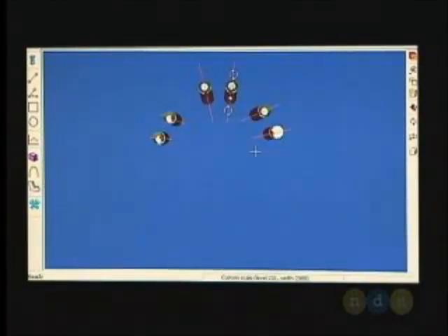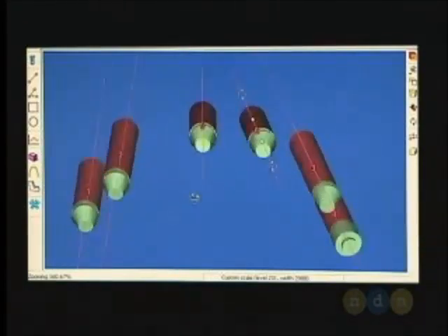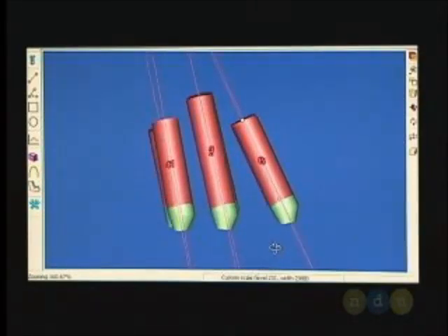And if I really want to take a look, I can remove the bone entirely and take a close-up look at how this comes out. Here are the 6 implants. Why is this important? Because I can now discuss with my restorative dentist the angulation concerns. Take a look at how the bicuspids and the implants in the posterior and anterior are going to line up. We're going to use angulated abutments, and you're going to see during the surgery.